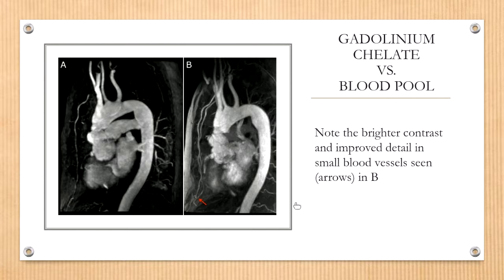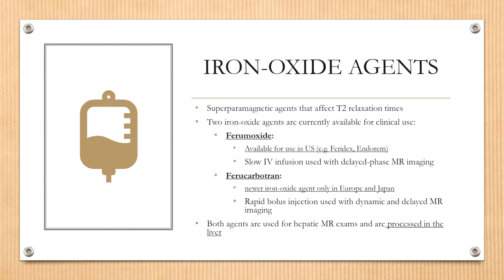And so just by looking at these images, you can tell that there is a significant benefit to using these blood pool agents. But of course, we'll find out later on that in order for us to use any type of contrast, we have to make sure that the patient can actually get the contrast and tolerate it.